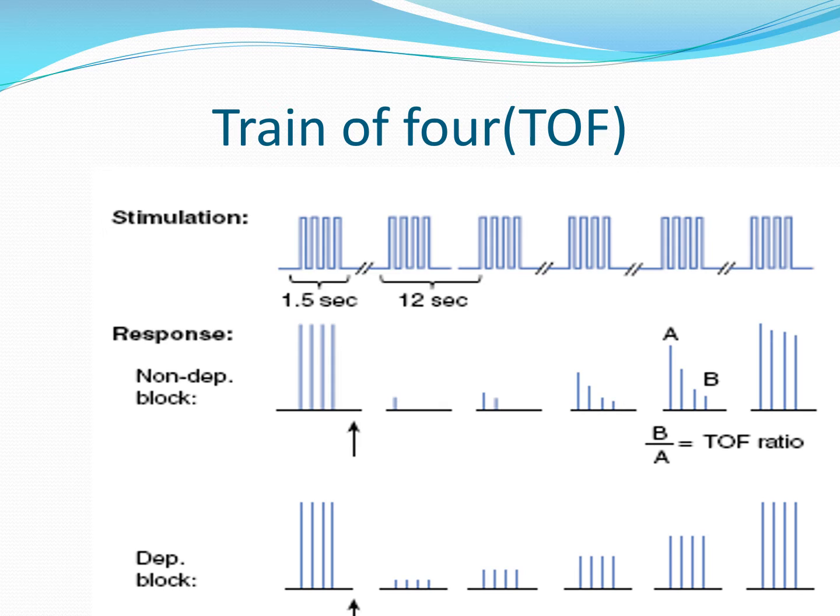And of course, we cannot speak about train of four ratio in the depolarizing relaxant block because it is always one.